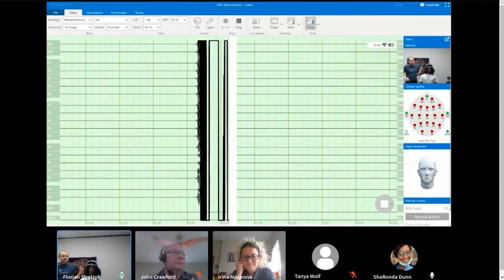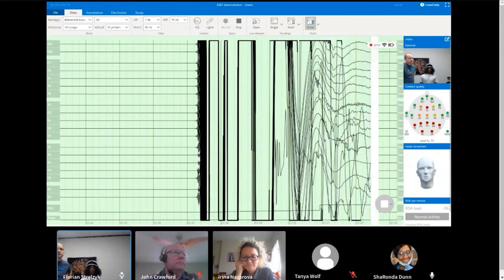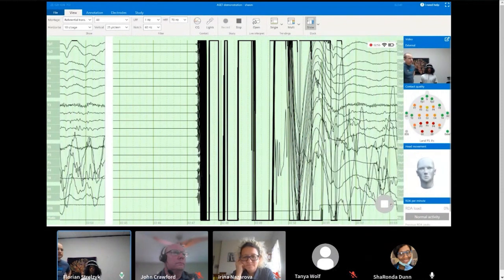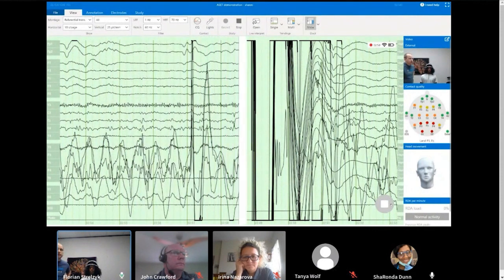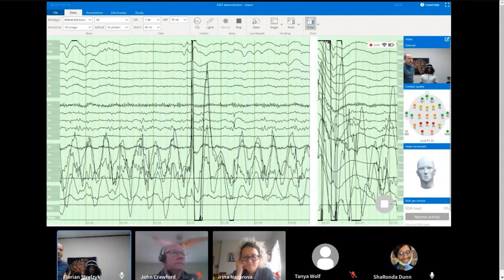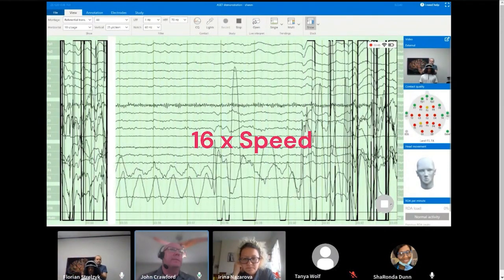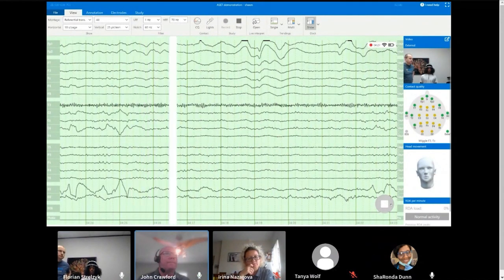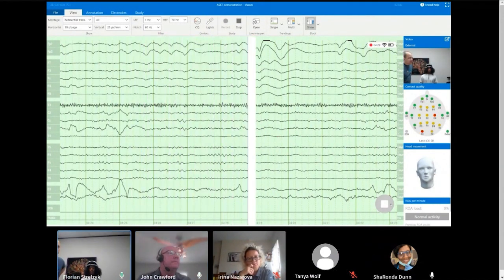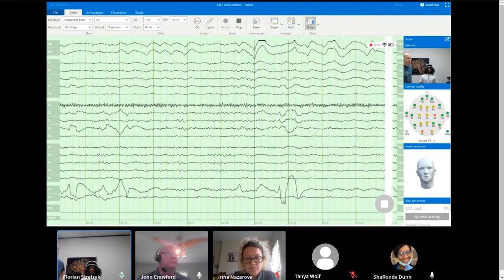So we're at about the halfway point, and let's see how many electrodes already give us some signal. And you see a good amount already do. And we really only have the P band and maybe a 1 or 2 that I still need to pay attention to a little bit. So the way it looks right now, we are on all yellow. That's a good point. We're at about a 4-minute mark.